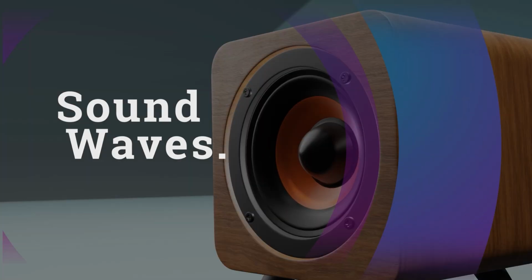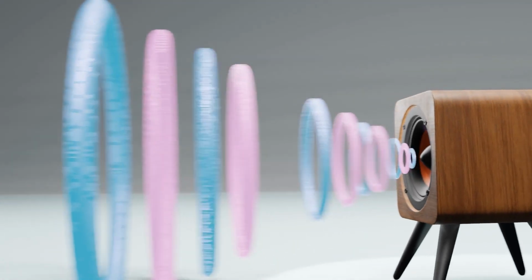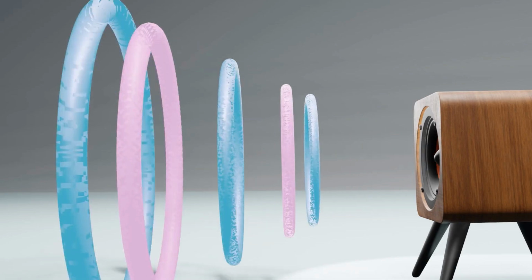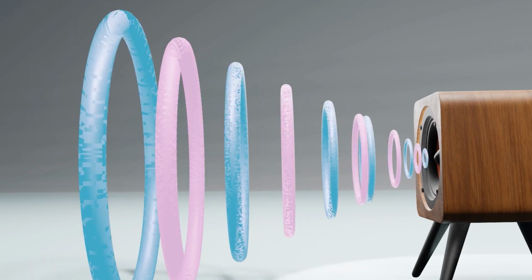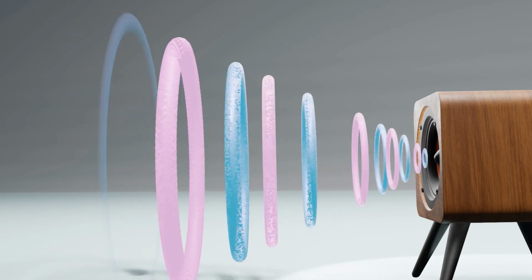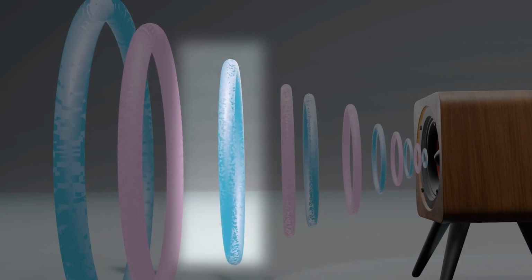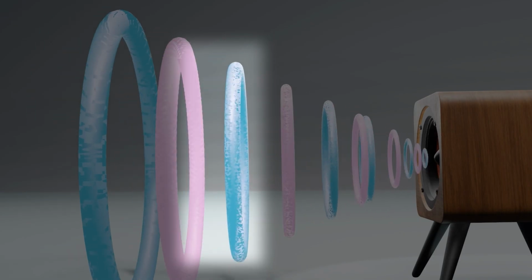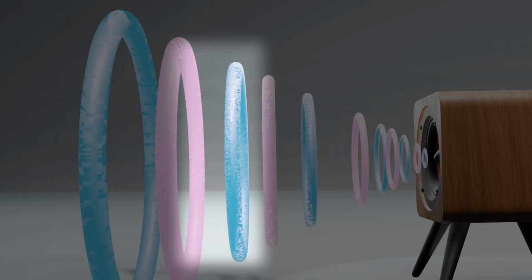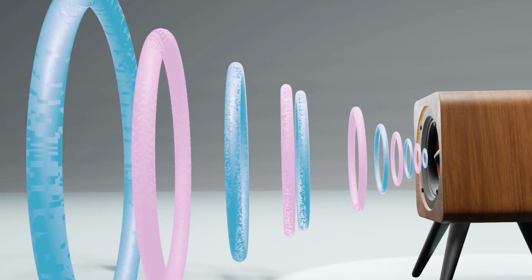Sound waves. Sound waves are mechanical vibrations that alternate between expansion and compression of any physical medium through which the sound wave travels, with the exception of a vacuum. It is an oscillation of pressure transmitted through these mediums. These waves travel in a straight line on its longitudinal axis, and the medium's molecules move back and forth. A particle that is in resting condition is first disturbed, causing it to vibrate, which then exerts this force on the adjacent particle. That first particle then returns to its original position. The particles of the medium do not move forward themselves, but the vibrations are carried forward.